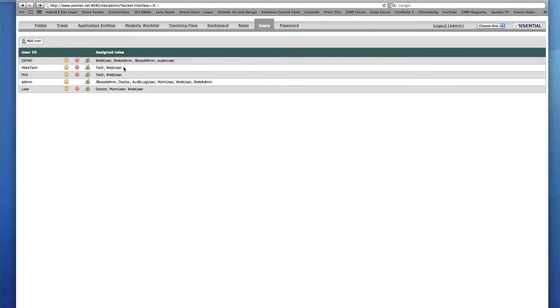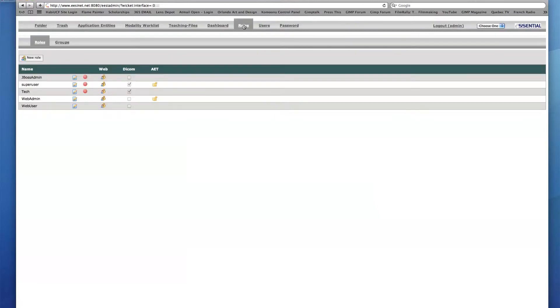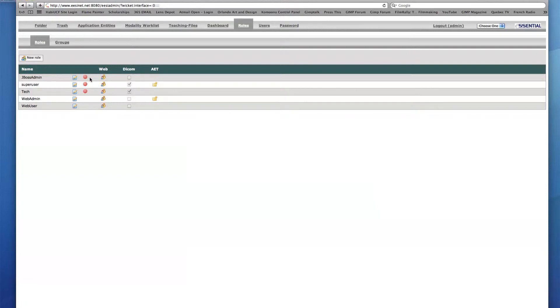I would now like to further refine the capabilities of Mike Tech and I can accomplish this by entering the Roles tab and creating a new role. You'll see that there is already a list of roles in the EasyPax archive, and each role has a set of icons next to its name along with three groups titled Web, Dicom, and AET.